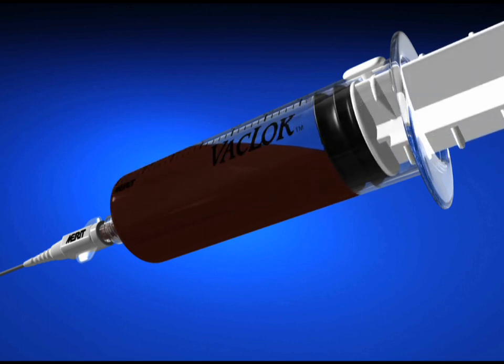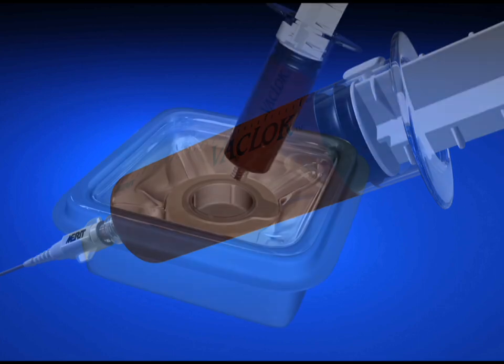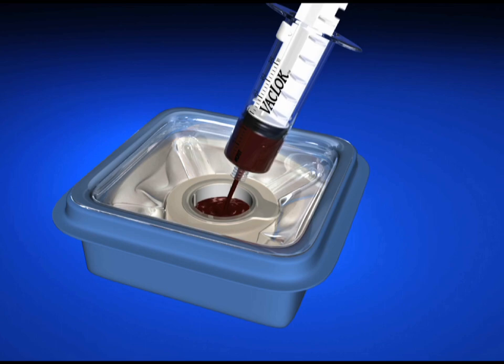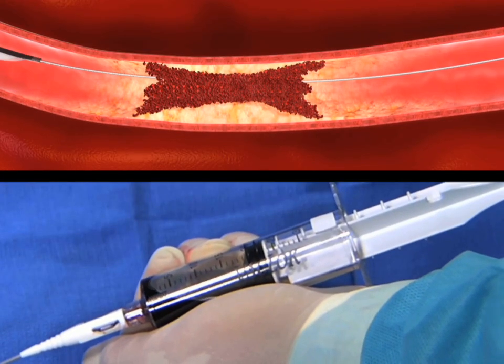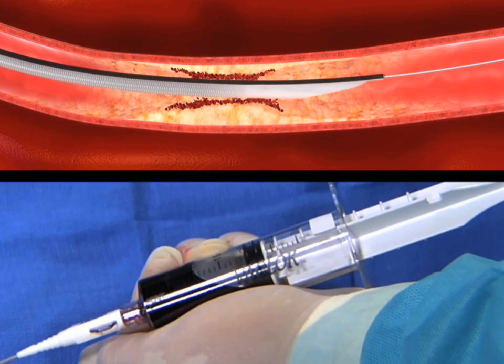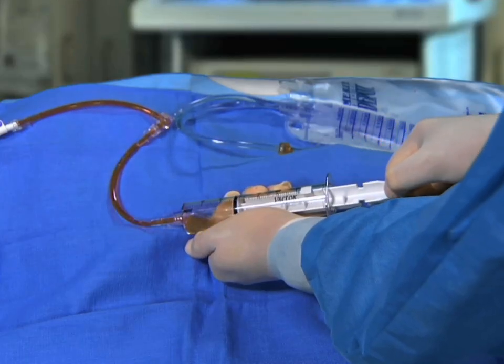This will create a sustained vacuum to assist in the desired fluid removal. Once the syringe is filled, disconnect it and unlock the plunger to allow the fluid to be flushed from the syringe. Common procedural uses for the Vac Lock Syringe include clot or thrombus aspiration and abscess drainage related procedures.